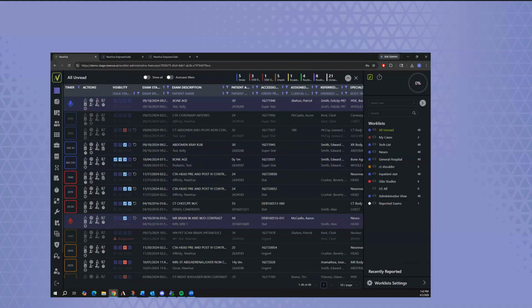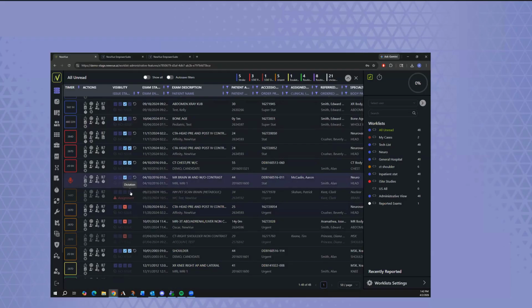So here you see there's a whole host of other options available. Some simple ones like manual assignment and changing the priority, again standard interaction tools you'd want from an administrator or from a radiology support staff person. We have visual indicators for, is this exam ready to read? So we have this concept of passing gates or checks for what exam is appropriate to put in front of a radiologist. You don't want the radiologist seeing final exams or scheduled exams, but how do you determine what the appropriate status is for reading?